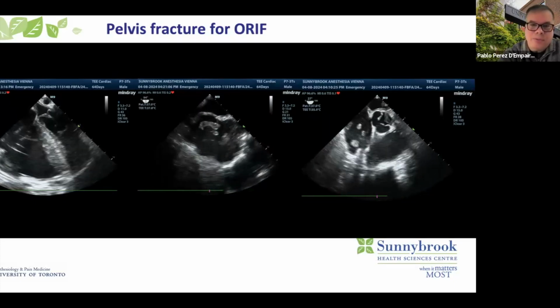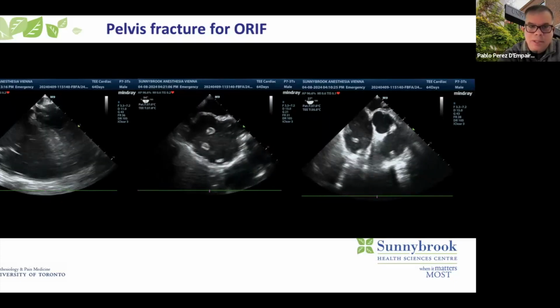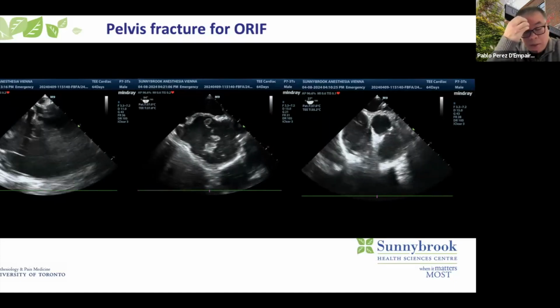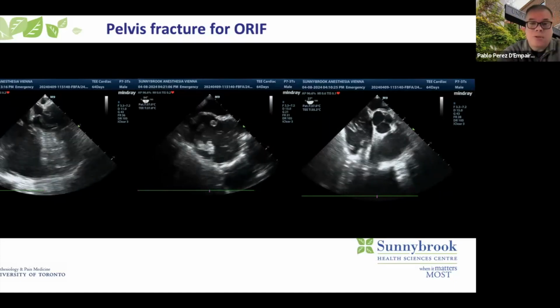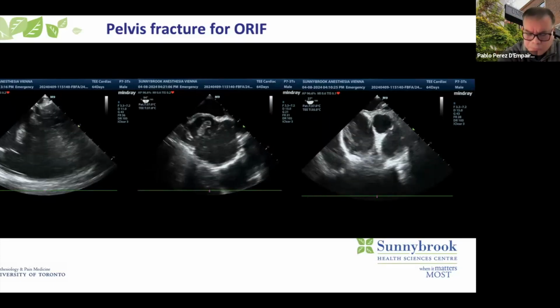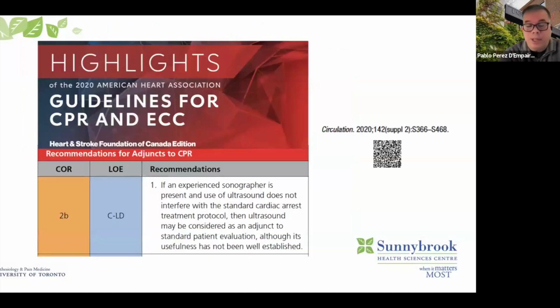So having this diagnosis, we were able to call the cardiac surgeons immediately and the thromboembolic service immediately to try to decide what would be the best course for this patient, and we decided to do a crash sternotomy and a thrombectomy. And this is what they actually got out of both the pulmonary arteries, and this patient was able to survive after a couple of weeks in the ICU and left the hospital home without any type of sequelae.